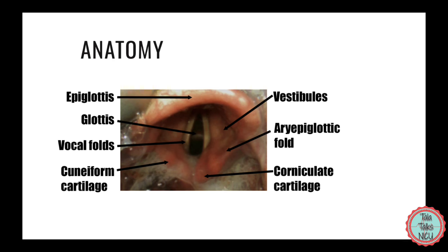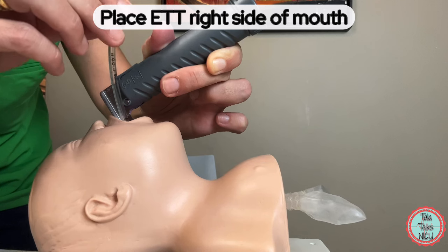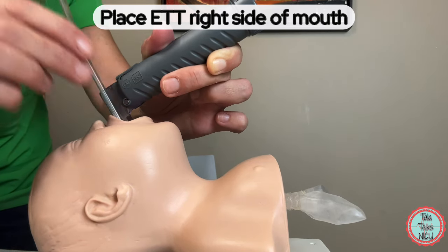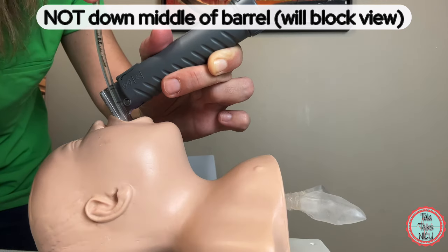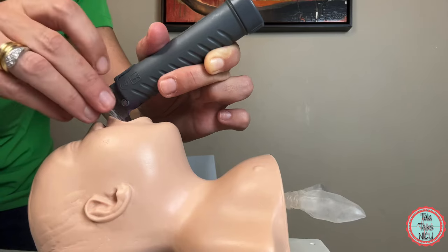Once you identify the vocal cords, put the endotracheal tube in from the right side of the mouth and thread it down until you can see it pass through the vocal cords. Don't put it down the middle of the blade because that will block your view of the vocal cords. Put it down from the side of the mouth and thread it through like this.